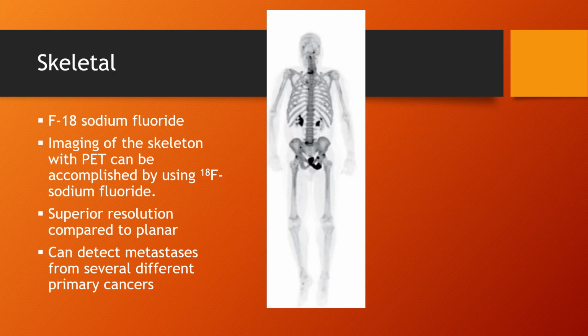So sodium fluoride is very similar to MDP. It is imaging of the skeleton with PET or PET-CT, and it can be accomplished using F18 sodium fluoride. So this has superior resolution compared to planar imaging, and it can detect metastases from several different primary cancers.